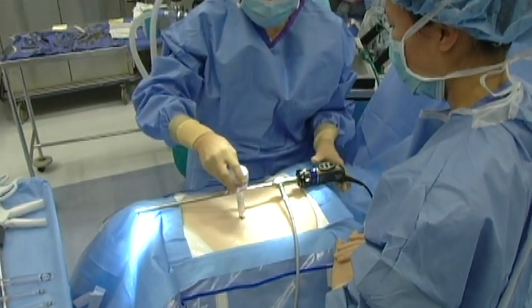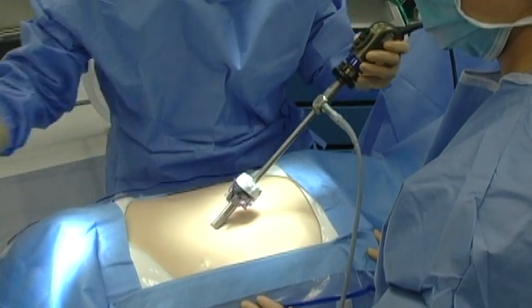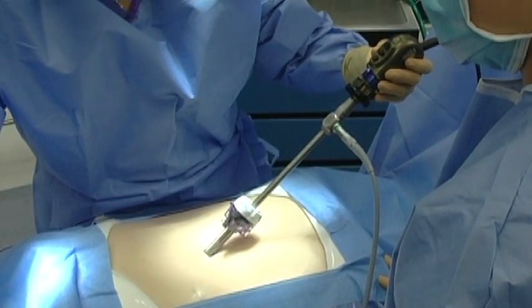For the purposes of this procedure, we'll have an umbilical trocar which we can put our camera in. And then laparoscopically, we're going to watch as we put three other trocars in.